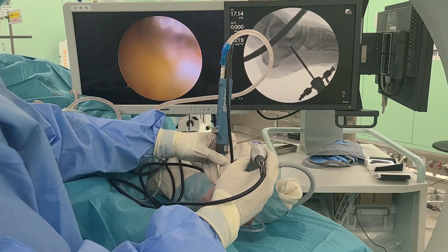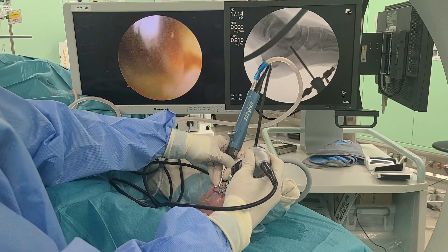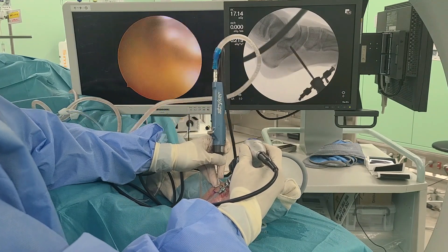After abrading the majority of the bone, a 2.3 mm 30-degree arthroscope and a 3 mm abrasion burr are introduced through the portals, and the accessory navicular remnant is resected.